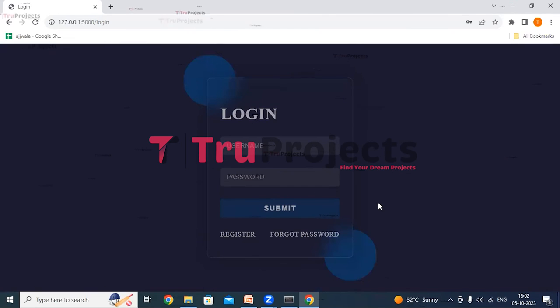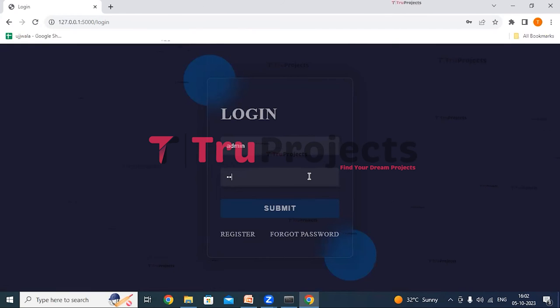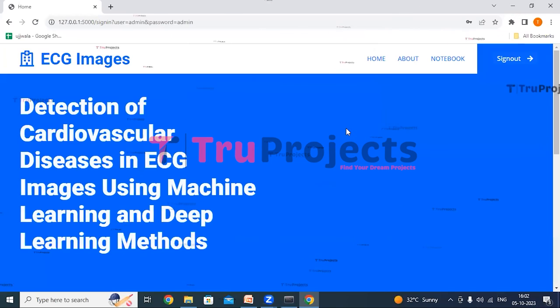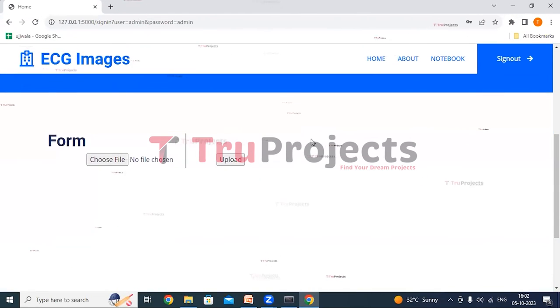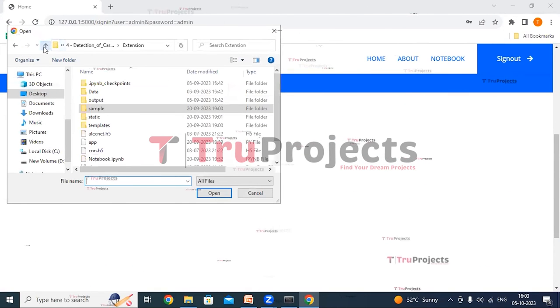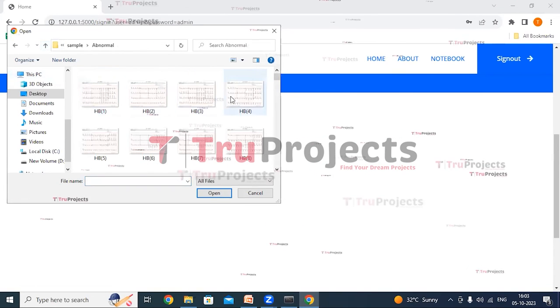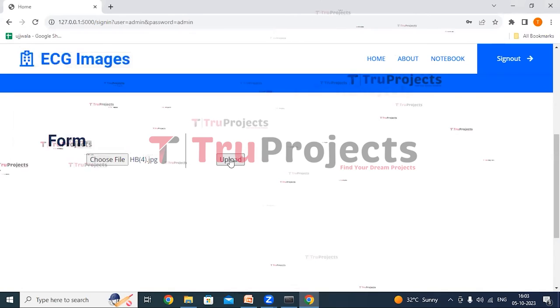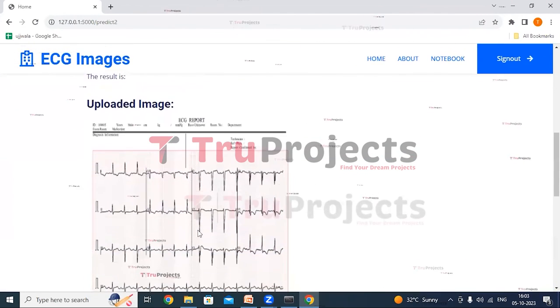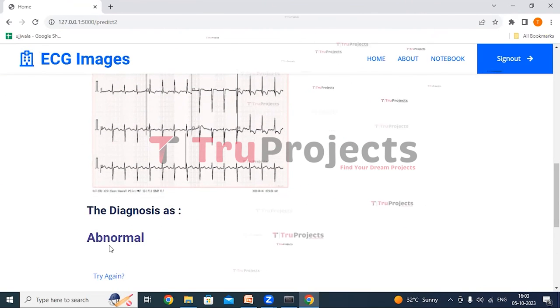Here we provide our username and password and click the submit button. It has redirected us to the detection page. Here we upload the ECG image by clicking the choose file button. From the sample images folder, from the abnormal folder, selecting the fourth image and clicking open. Now clicking the upload button. This is the uploaded image, and this is the diagnosis — it has diagnosed it as abnormal.